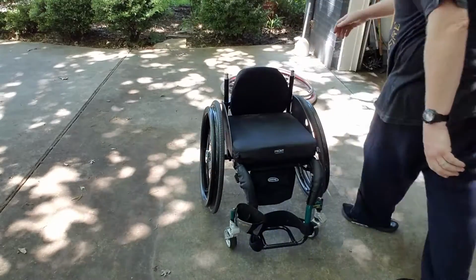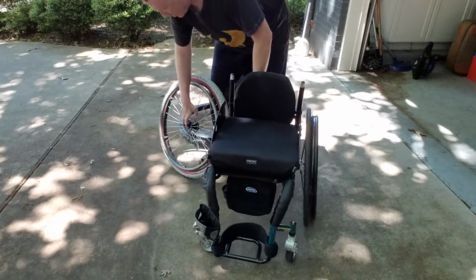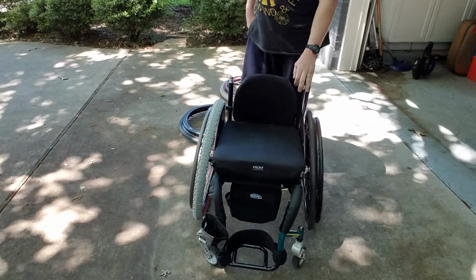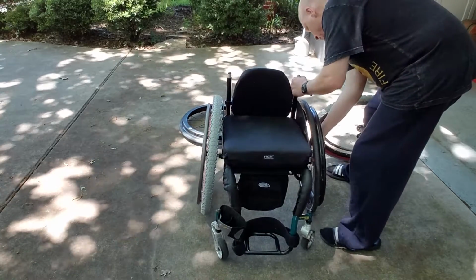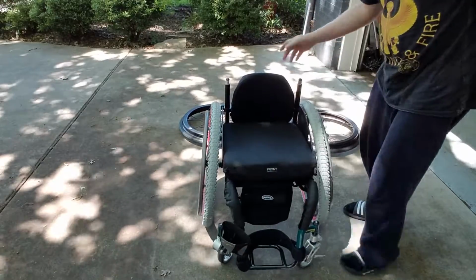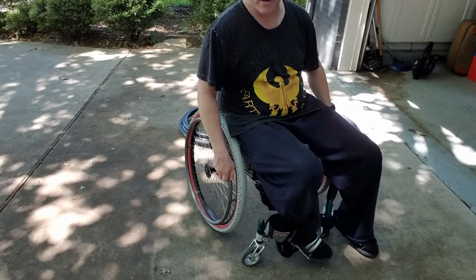The off-road wheels attach in exactly the same manner. So, same kind of push button, push the button, slide it in, and there you go. And like so. And now they're ready to go. And you can move out. It's slightly different grip on the chair. It has more of a bar.